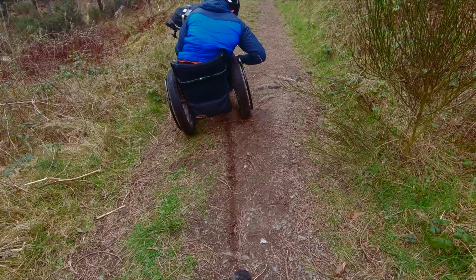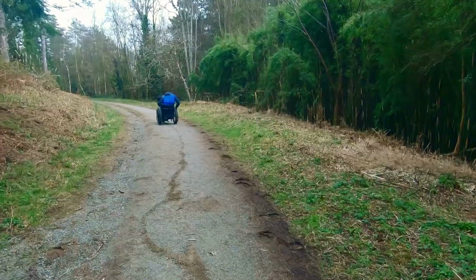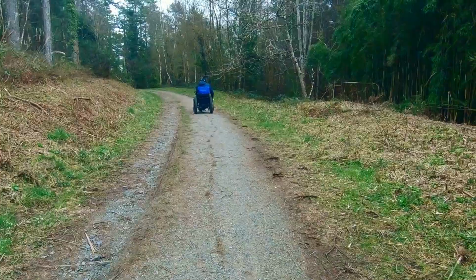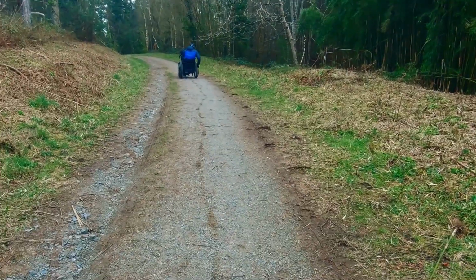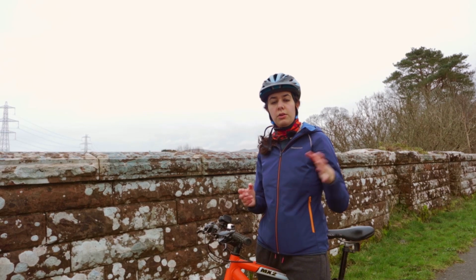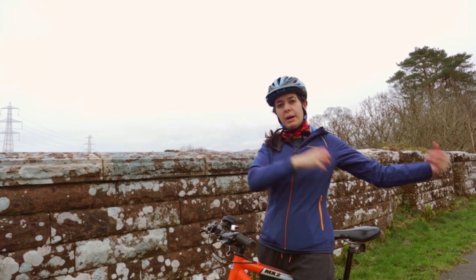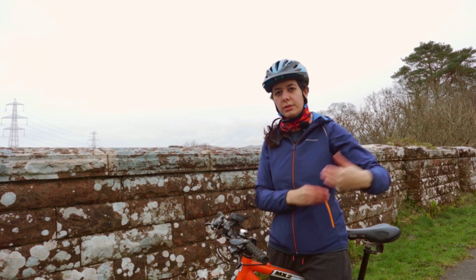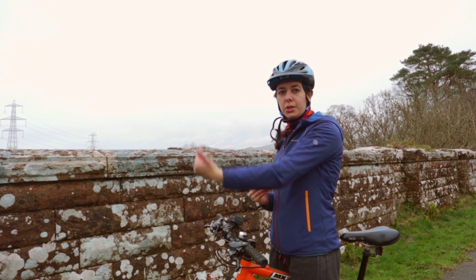Ooh. Oh dear, we reached an impasse. So we're on the supposed bike path and we have got slightly stuck. One limitation we've discovered with the Batec is that it can struggle going up hills. When you go uphill, your weight tends to be back over the rear wheels. Now this is fine on a normal bike because that's where your power is coming from, so it still has grip to push you up the hills.